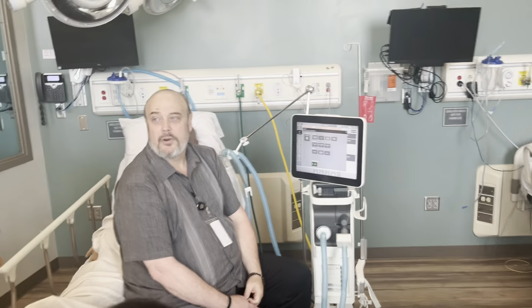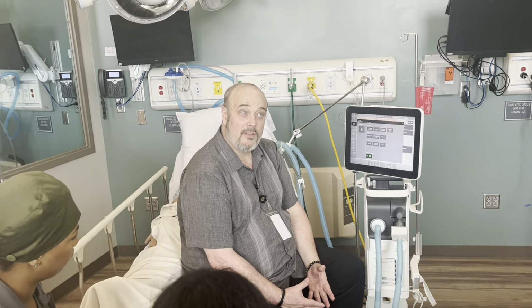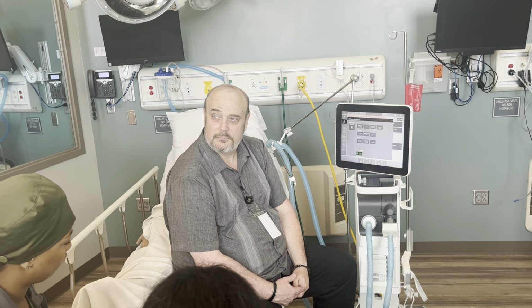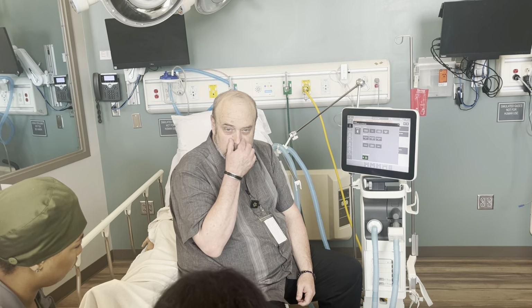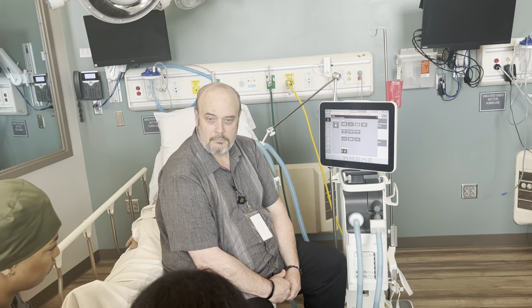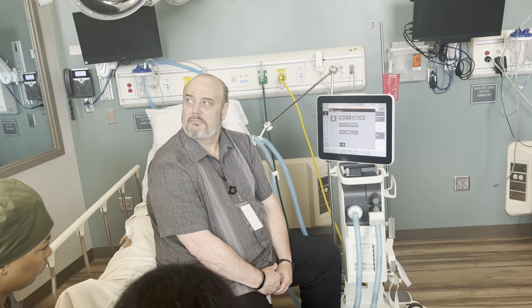And basically what I'm pointing out to you is there's definitions to a mechanical breath versus a spontaneous breath. What's the difference between CPAP and PEEP? CPAP is just continuous, and PEEP is only expiratory, positive end-expiratory pressure. Okay. But they both do the same thing, right?